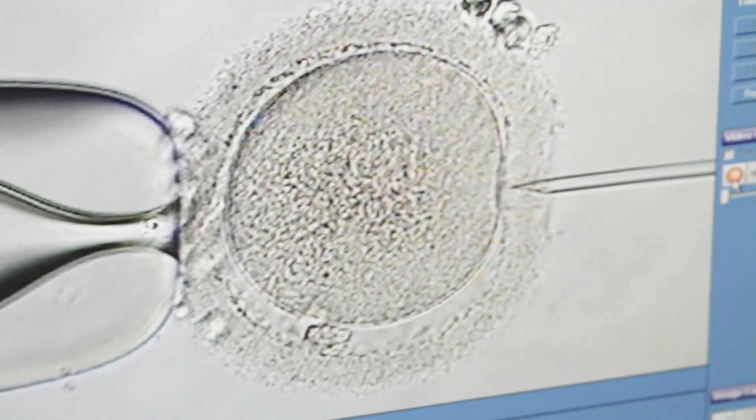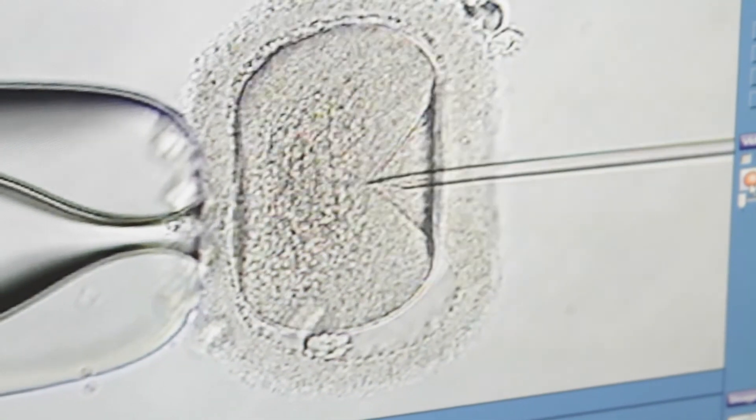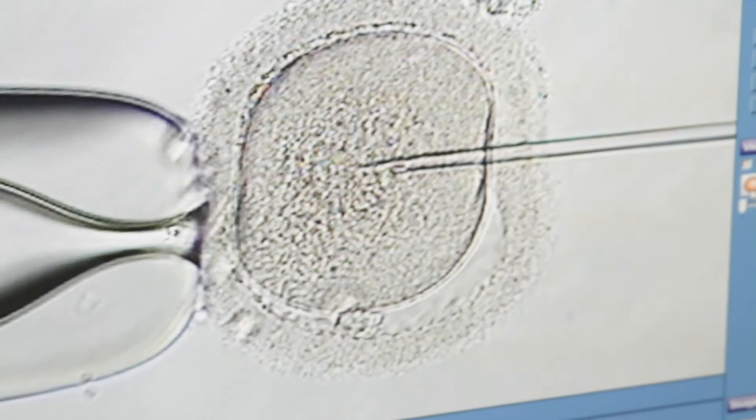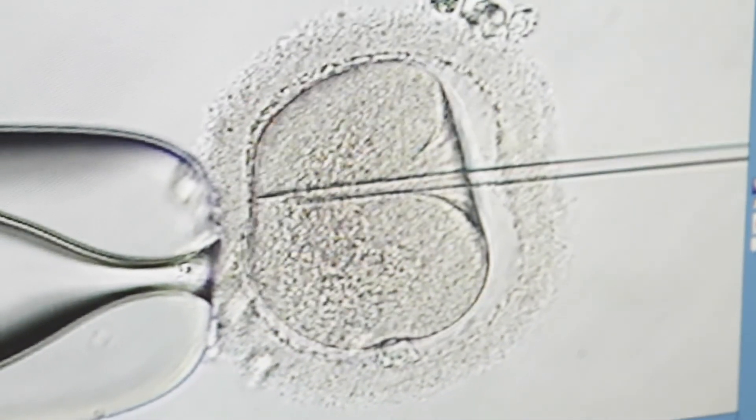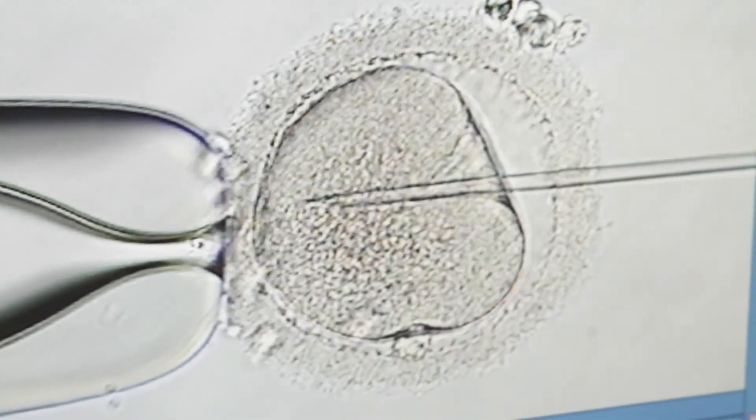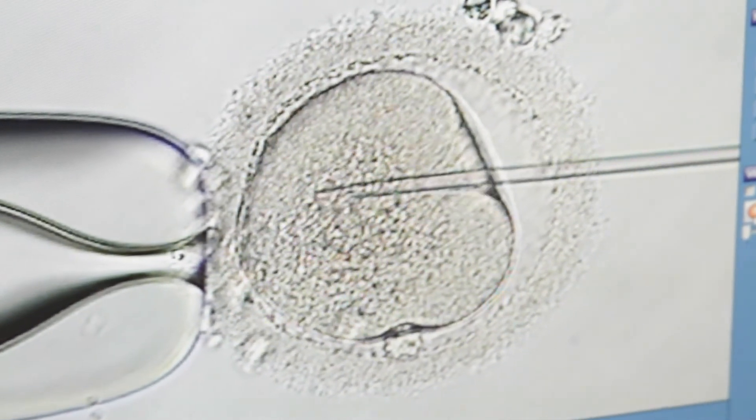You can see with this shot how that micropipette is only just slightly larger than the sperm itself. It's approximately the same diameter as a single human hair, so it really is very tiny.